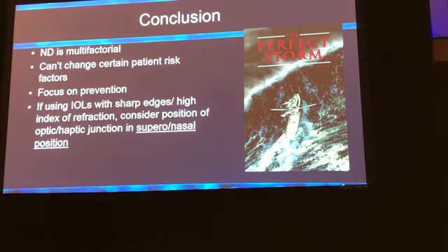So conclusions: multifactorial, we still don't know exactly what it is. I think it's a combination of factors because there's no one thing that we can point to, but if you're using a one-piece acrylic, go ahead and put it horizontally, and I think that will help.